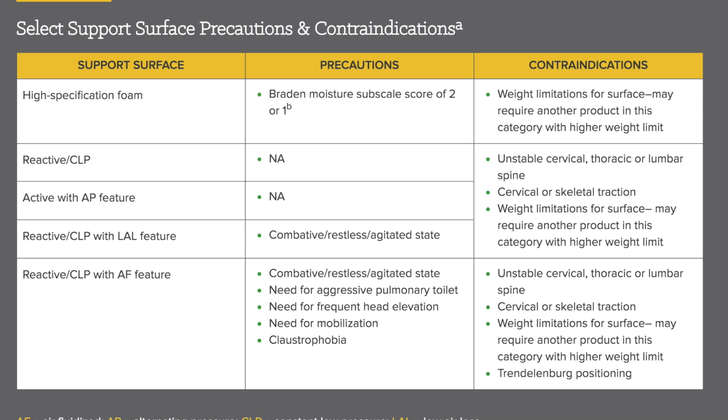For the most part, Dr. Hongali, this is all you have to do. Once you order what you want, our portable equipment team will get you the brand of therapy that we have on our contract. But if you are wondering, what kinds of products do we have here at Cone Health? What if a patient tells you they sleep on one kind of mattress at home and you are wondering if it is the same as the one we have here? Then this last table is for you.